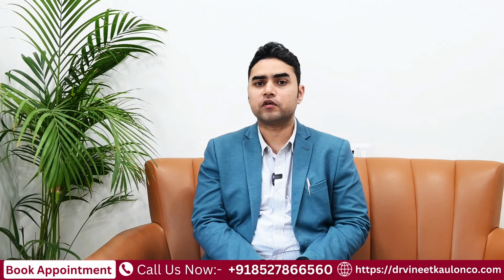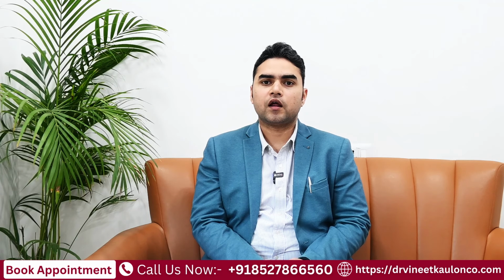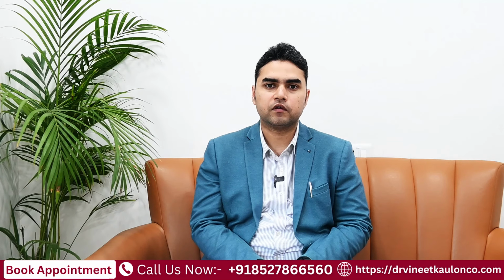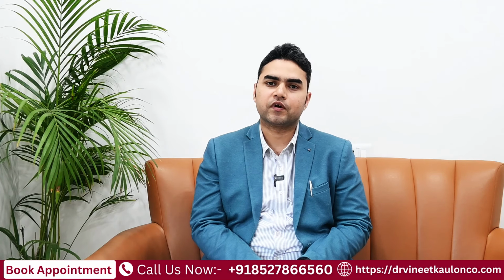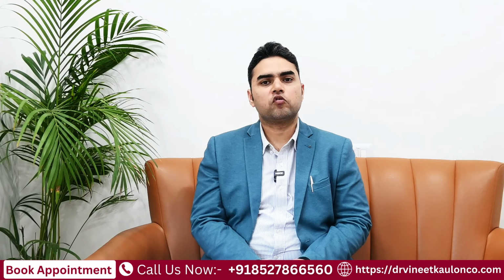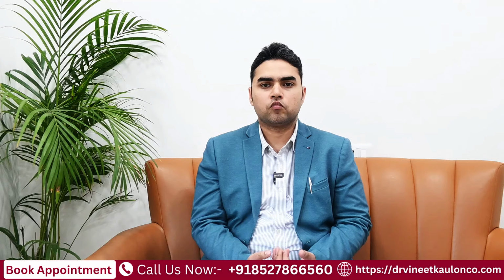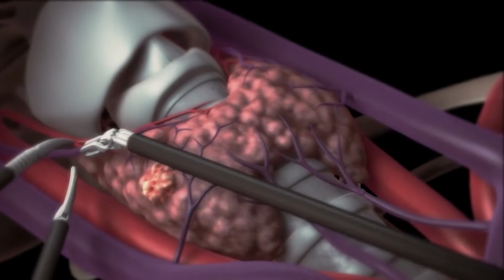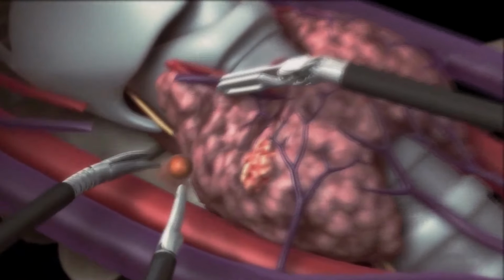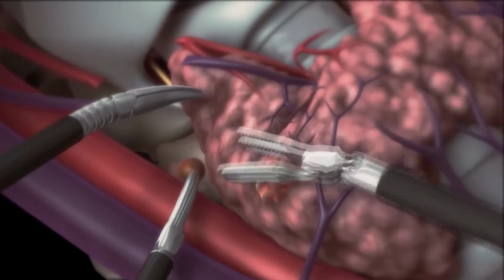The complications I'm talking about, nerve damage and hypocalcemia, are very common. They are around 10 to 15% with the conventional or open techniques, while very low, like less than 1%, with robotic thyroidectomy. Also, coming to robotic parathyroidectomy, the parathyroid gland can be removed with a similar approach and without making any cut in the neck. And yes, as I talked about, the easy identification of the parathyroid gland means no other surrounding structures are damaged during the surgery.